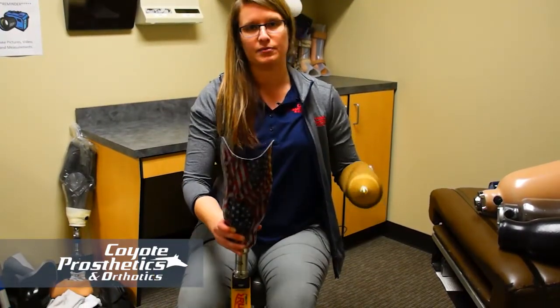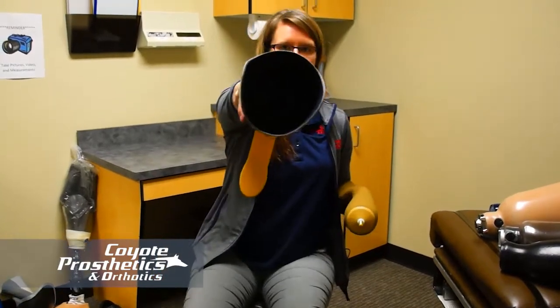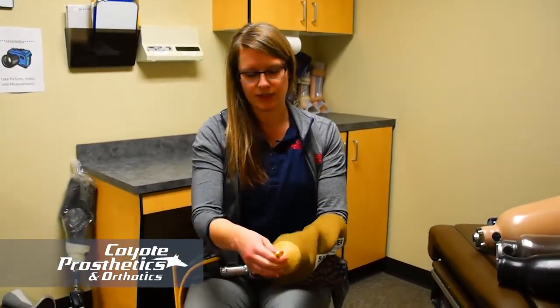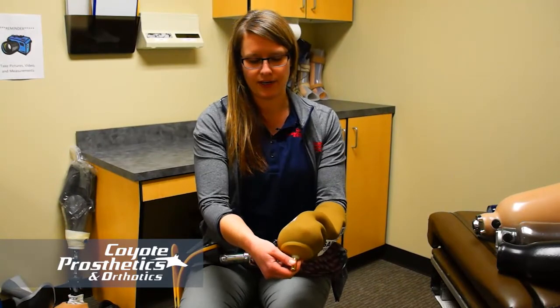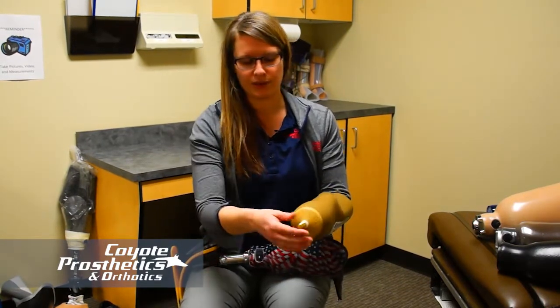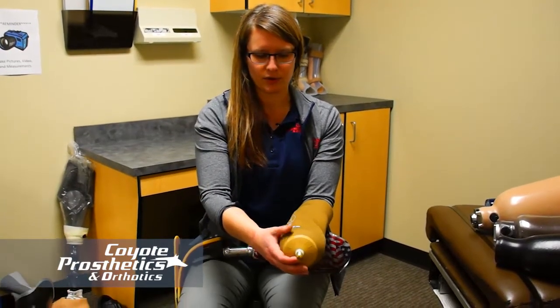Now with this, sometimes the pin will get in the wrong spot. If you look in there, there's a hole in the bottom that the pin goes in. Sometimes if you put this on and the pin is rotated a little bit, if it's too far forward, too far off to either side, or too far down, you'll have trouble engaging the pin. So that might be something that you want to play with. You want this to be as straight as possible.